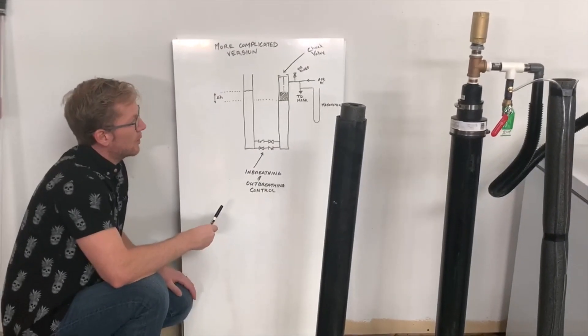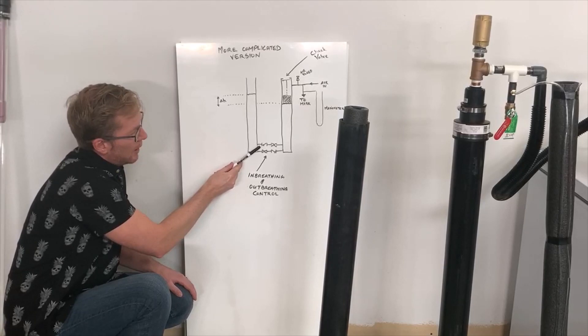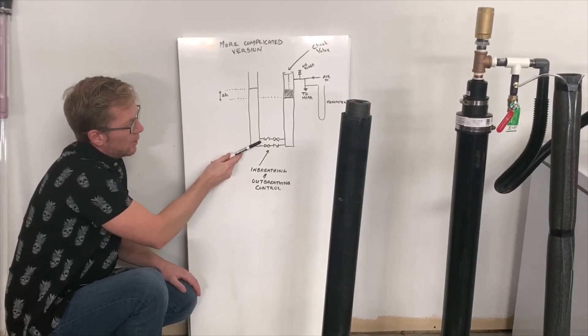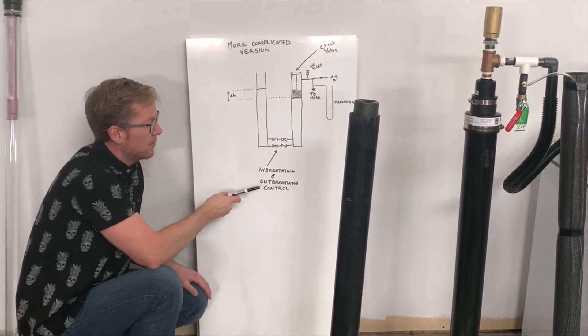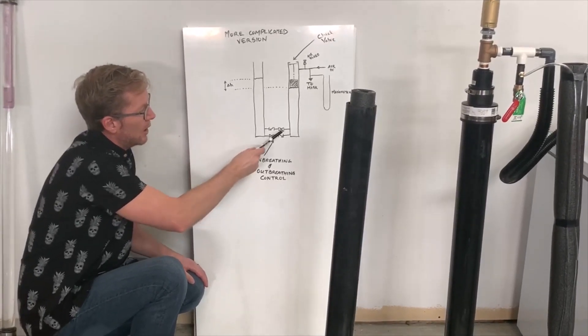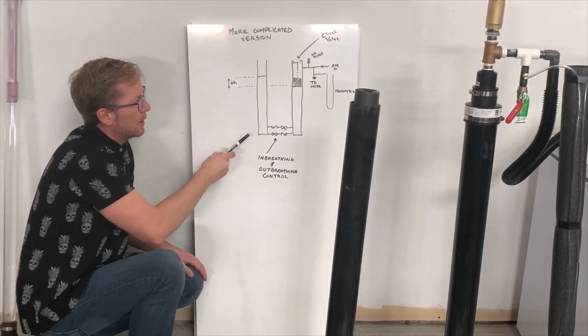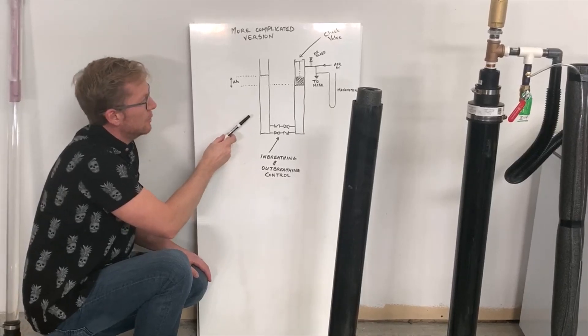A slightly more complicated version of the system has two lines on the bottom of the U-tube, each one with a check valve and a manual valve so you can adjust the rate of in-breathing versus out-breathing by changing how easily liquid can flow in one direction or the other between the sides of the U-tube.